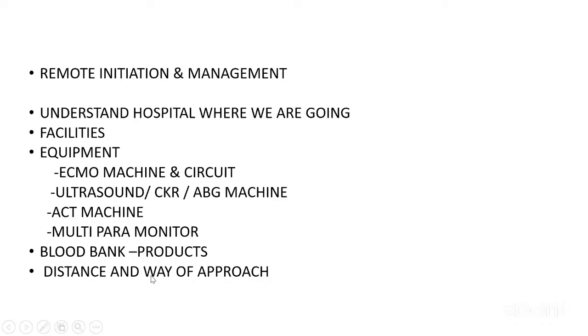So whenever you are going for a remote initiation, we have a good checklist for this. At the end, we'll discuss the checklist where we go systematically through these things. But these are the basic things which we need to understand. Understand the hospital where you are going, what facilities they have, all the equipment they have, or whether you need to take some equipment. If at all, you can send them some checklists and get them to arrange a few of the things for you.